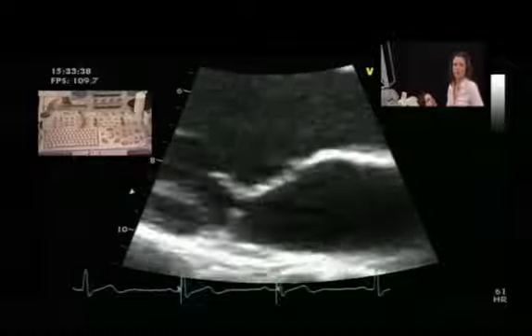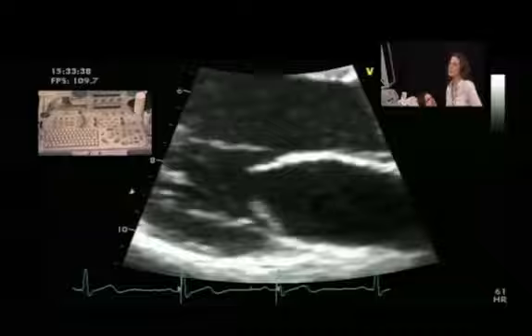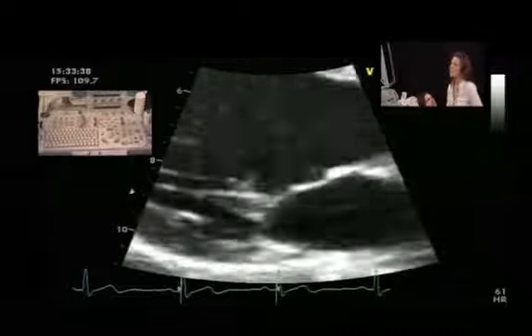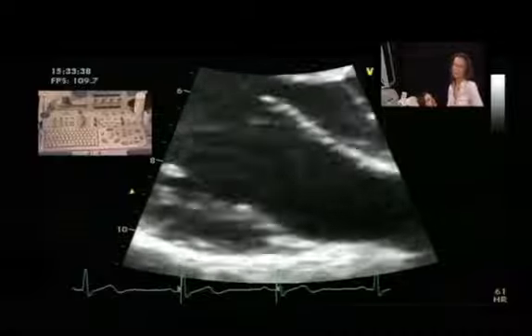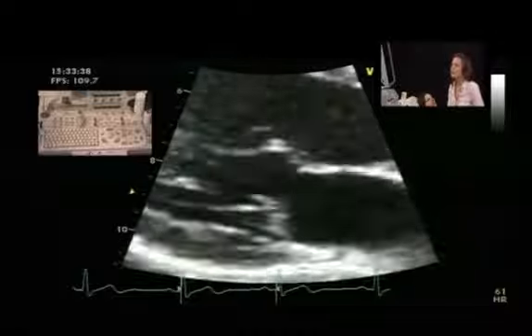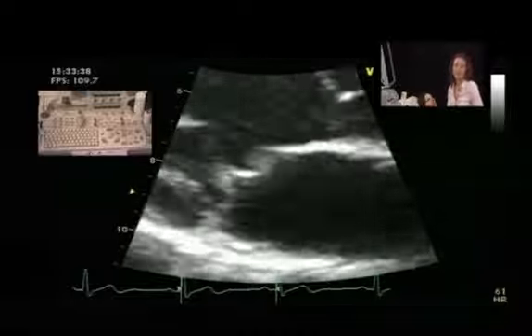So I'd like to show you now something about reviewing the images and what is the advantage of these high frame rate images. You see here I have already stored an image from the mitral valve with a high resolution zoom with 109 frames per second. If I just recall the image and look at the valve, it looks nice, but to tell the truth, the eye cannot look fast enough to detect the real very small motion. So we cannot separate these 109 frames.